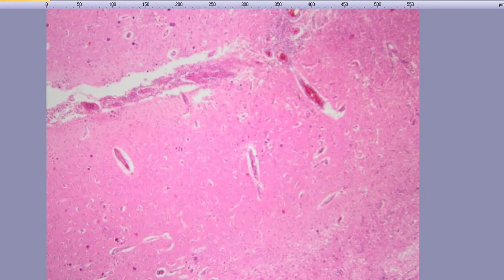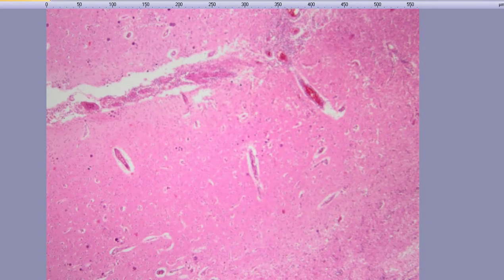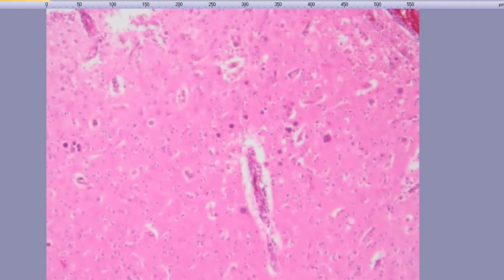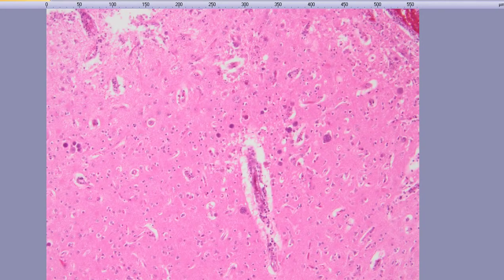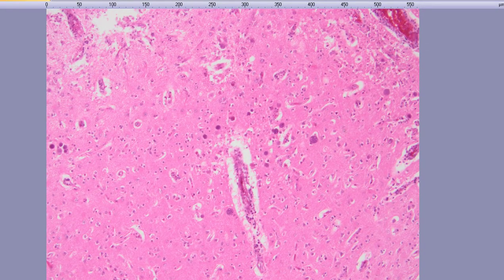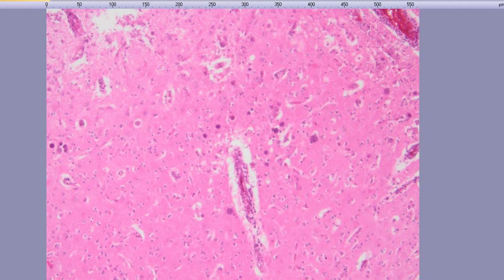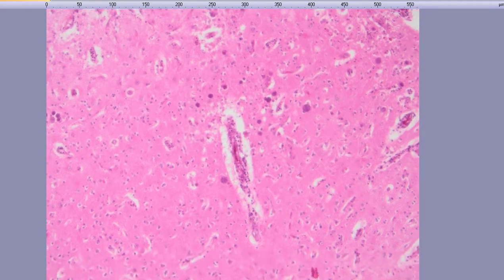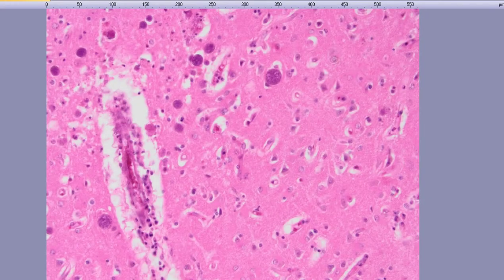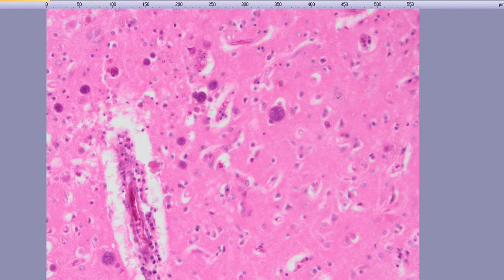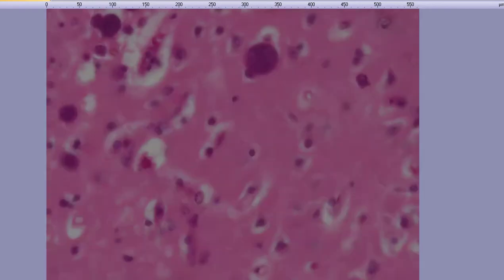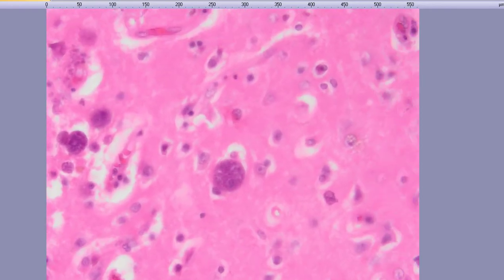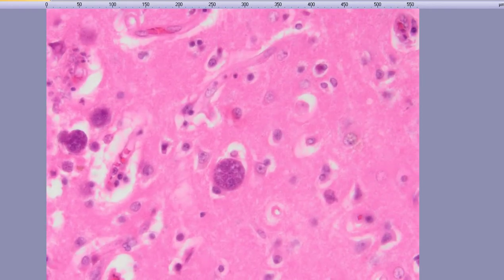This is the peripheral area where gliosis is more prominent and there's not much necrosis over here. And this peripheral area is where you see most of these bradyzoite cysts.